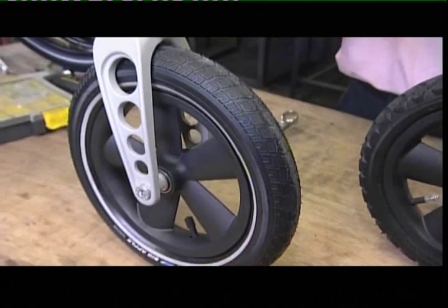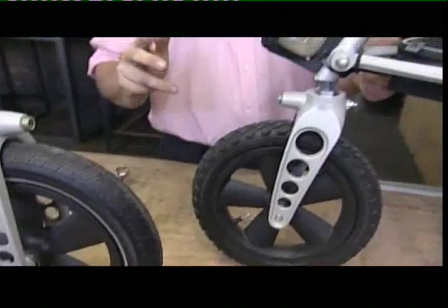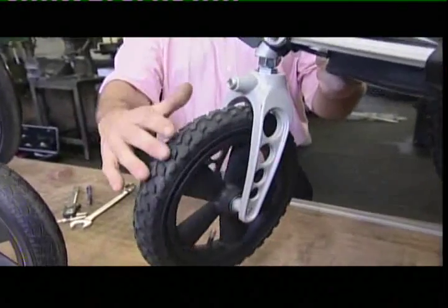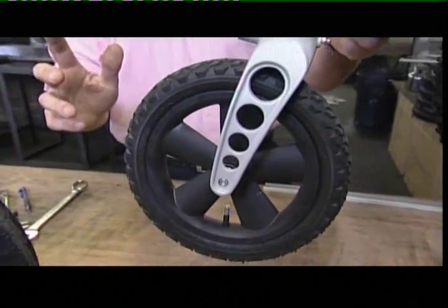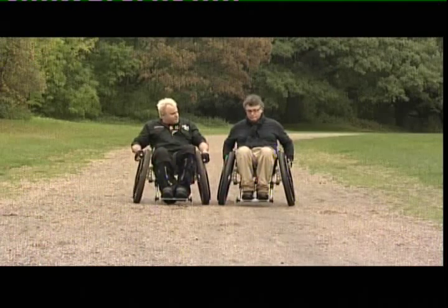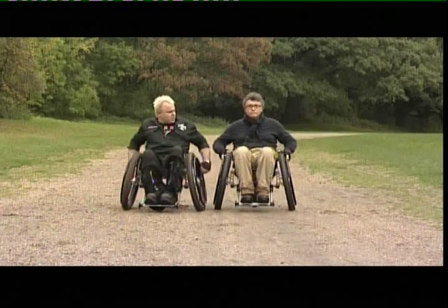There still remained the problem of the chair's inability to run in a straight line. I came to realise that what we needed was some sprung-loaded type of device in this rear caster that would make it lock when it went in a straight line. And this is the one feature that makes the three-wheel design actually work. But Mike, even at that stage, things still weren't quite right, were they?